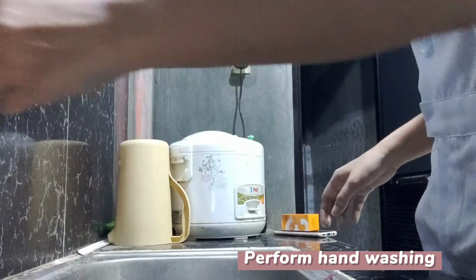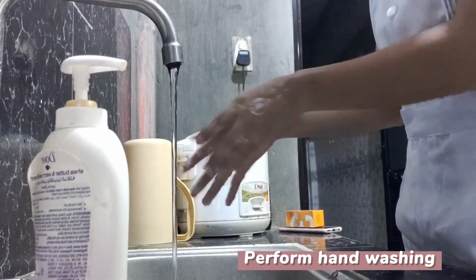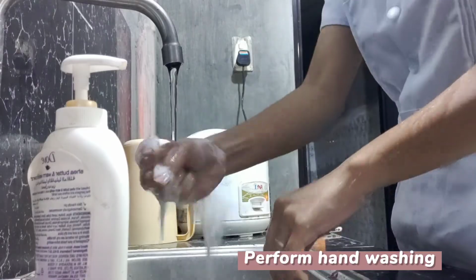Let's close it by the fishing technique. Now we will wash our hands and remove the gloves. I'm going to wash my hands. We will administer the medication according to the physician's order, okay? Thank you.